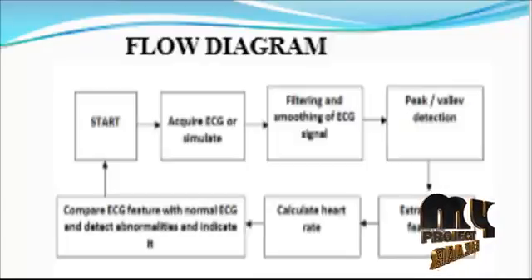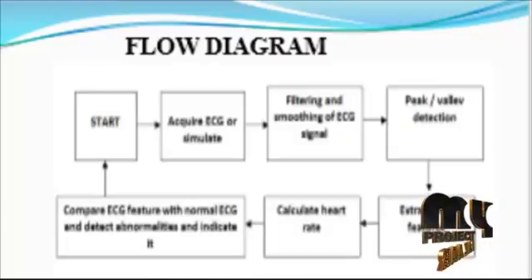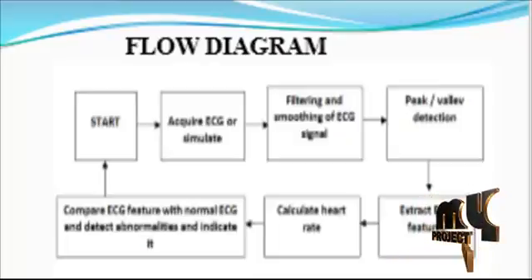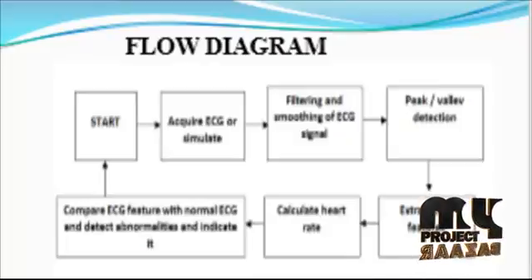The flowchart shown in the figure explains the applied framework, which is divided into three major parts: ECG pre-processing through the various filters, ECG feature extraction, and estimation of the disease. Detection of disease on the basis of heart rate and the obtained parameter deviations is done: the PQRS or QRS offset, QRS onset, ST level, ISO level.